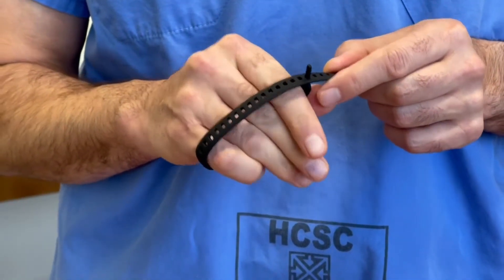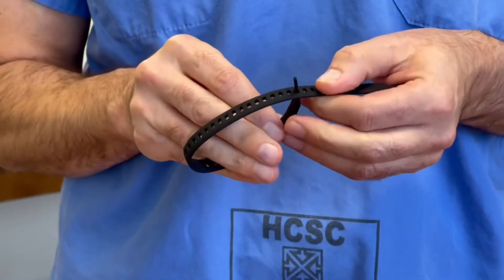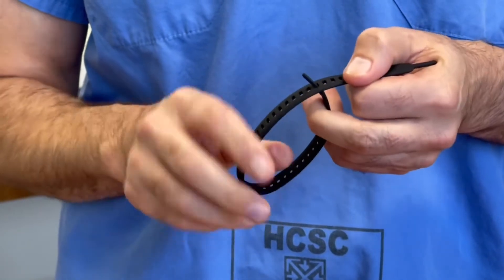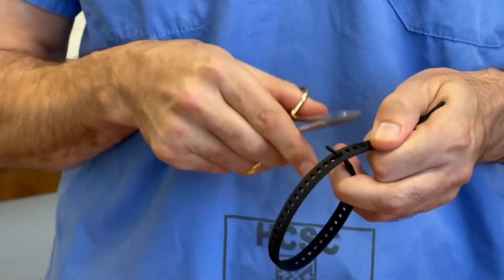After sizing, you remove the splint from the hand and your tab is through the appropriate perforation. Your first lock — the best practice — is to lock it towards the circle of the splint, not towards the free end.